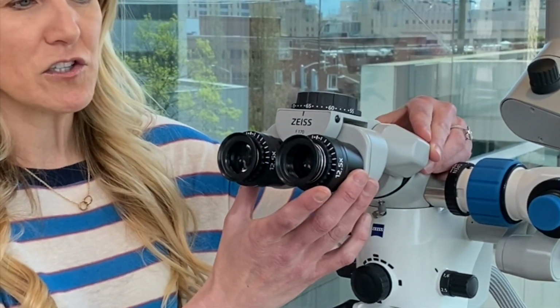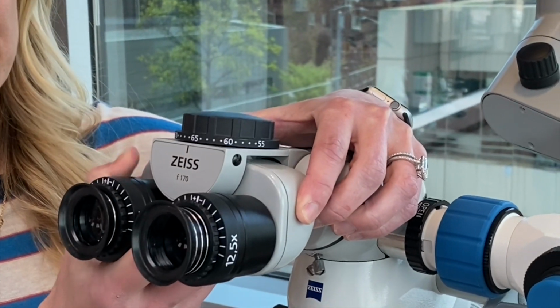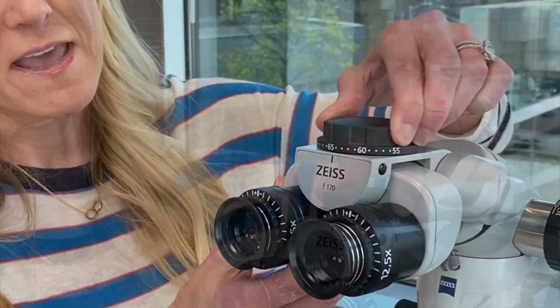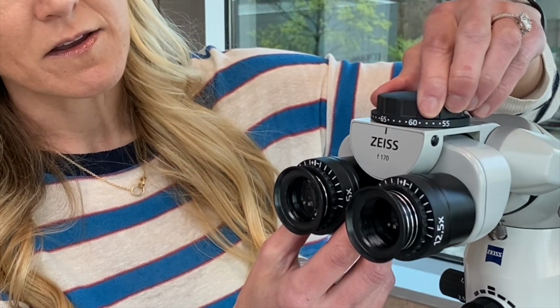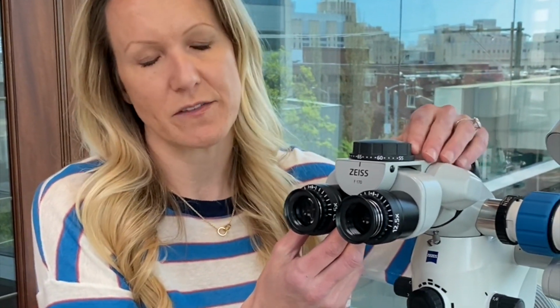So this binocular complex has a couple of adjustable pieces on it. The first would be just something simple like this that allows you to sit upright in a position that is ergonomically correct. The second, which is this on top, is called a PD knob or an interpupillary distance knob. These are different on different types of scopes. Sometimes it's not actually a dial; sometimes it's just the ability to move the two eyepieces in and out. But often there'll be a marker or a dial on it where you can record and remember where your interpupillary distance is so that you can keep track of it. This is helpful if you have more than one operator using the microscope.